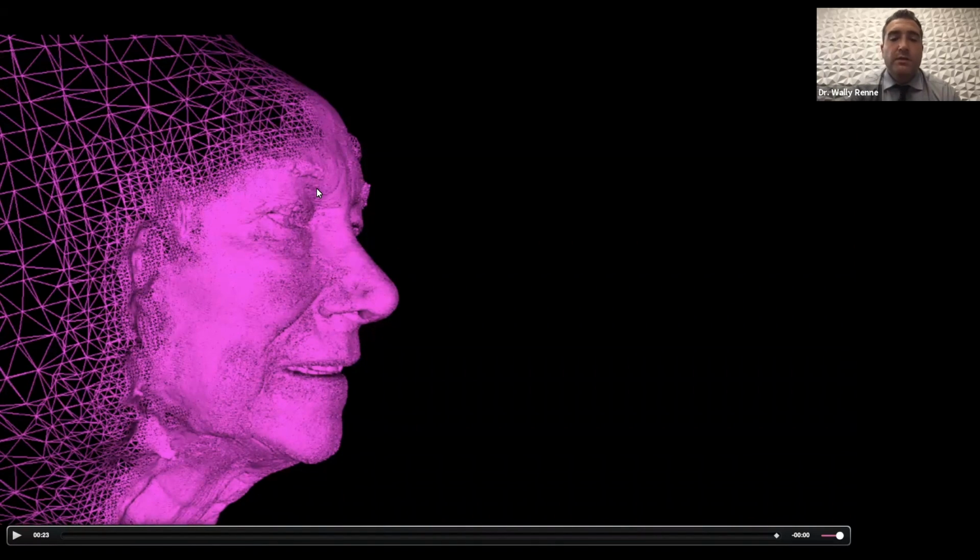There's other studies that look at the iris diameter, and the iris diameter could set the mesial distal width of the central incisor. For me, I always try to be in that 10 to 11 millimeter range. That patient had a Bolton discrepancy, so she definitely has a tooth size, arch size discrepancy, but people vary very little if you look at the aesthetic norm of what's acceptable. So it's very easy to set that 10 to 11 millimeter wiggle room and fall somewhere within there. That's kind of what I do.